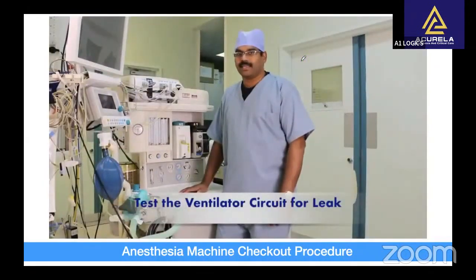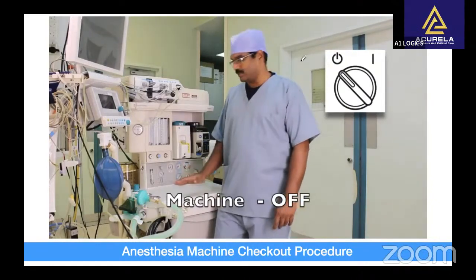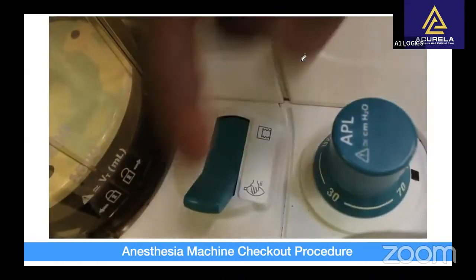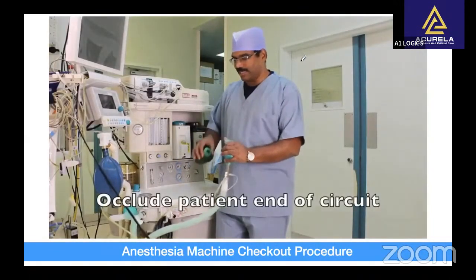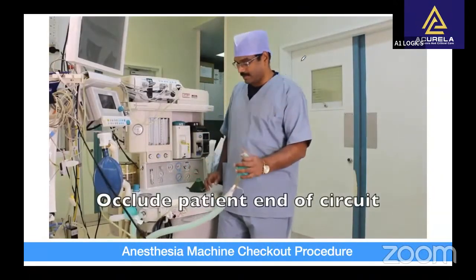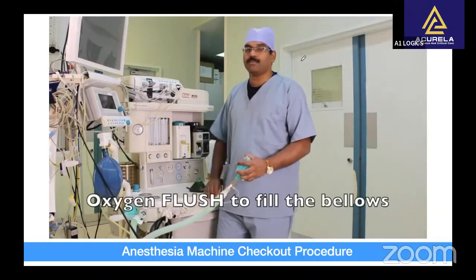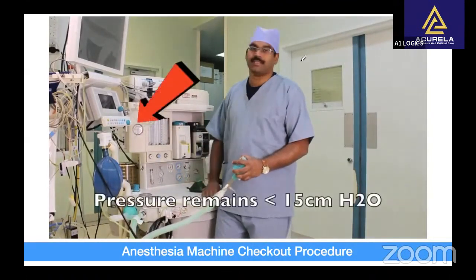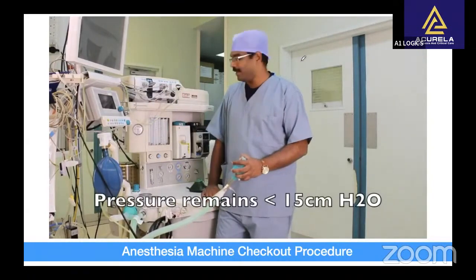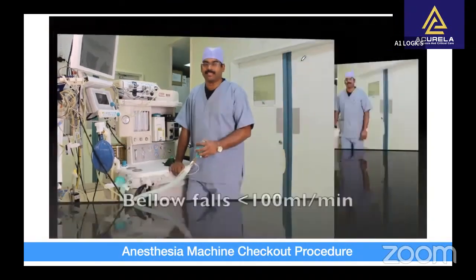Next step is checking for circuit leak in the anesthesia machine ventilator circuit. The machine as of now is in the off position. Select the bag selector switch to ventilator mode. Take the circuit, occlude the distal end or the patient end of the circuit, and then using oxygen flush, inflate the bellows and keep the circuit occluded. Make sure that the pressure gauge shows less than 15 centimeters of water and the fall in the bellows is less than 100 ml per minute.